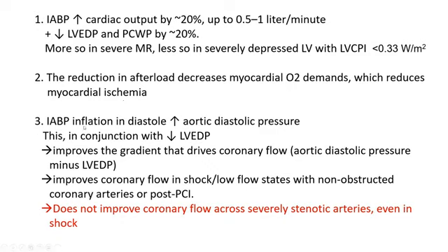The third effect, which can be confusing for a lot, is that balloon pump increases coronary flow, but there are caveats. Balloon pump inflation in diastole increases aortic diastolic pressure. Balloon pump also reduces LVEDP. Therefore, balloon pump improves that gradient, diastolic pressure minus LVEDP, which is the pressure gradient that drives coronary flow. So it improves coronary flow in shock and low flow states, but with non-obstructive coronary arteries.